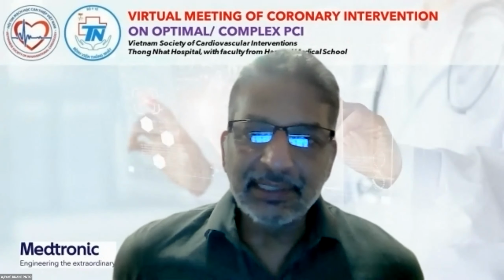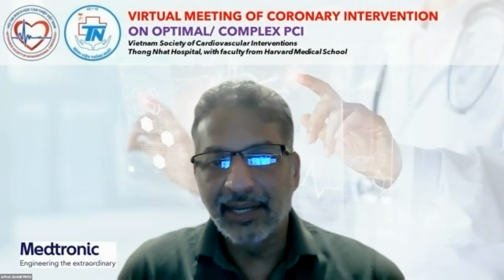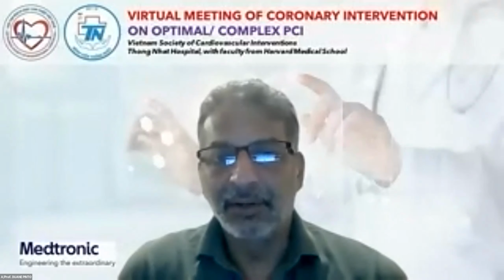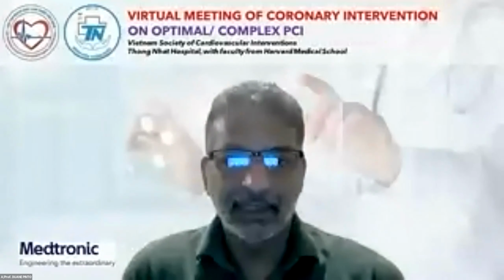Yeah, but I think we will have the same situation where you need some sort of debulking, because with all of those layers of neointima, especially if the problem is not calcium, I don't know that the lithotripsy will be enough. Maybe if the problem was calcium and it's cracked, now we can open the stent better. That's my hope, but it still is also very expensive for us in the United States. It's somewhere around $4,000, and you can't reuse the catheters or anything. It has only a certain amount of life, only certain pulses, and then it's done.